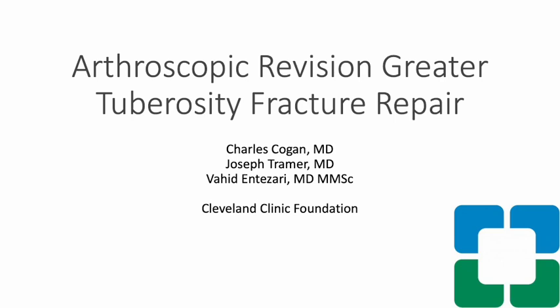The following video shares our approach to a unique situation for arthroscopic revision greater tuberosity fracture repair.